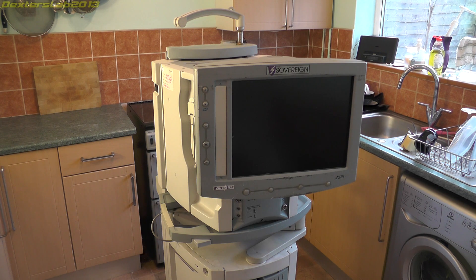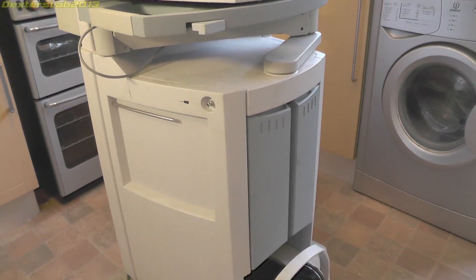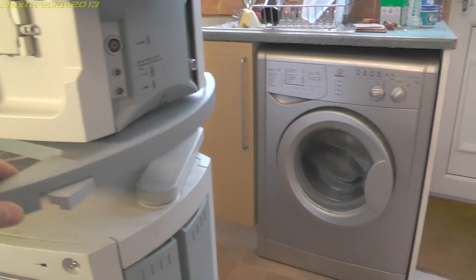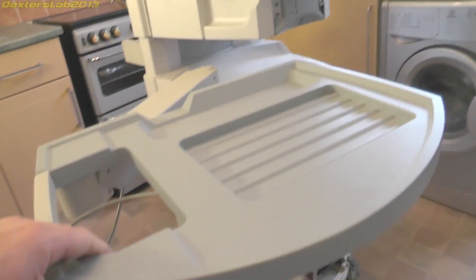I think the best thing to do with this is take some bits out and get up to the lab where we can actually look at it properly. This is the base of the unit, and then we have that table that came out — it's on a rather nice extendable arm.